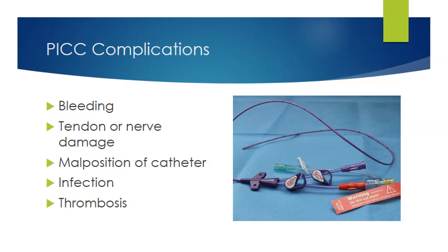Malposition of the catheter. Okay, so we want to avoid any excess muscle contraction in that area that could lead to that catheter being dislodged or even occluded. Infection, we've already talked about that, but obviously there's a risk for infection there. And also thrombus or thrombosis formation.